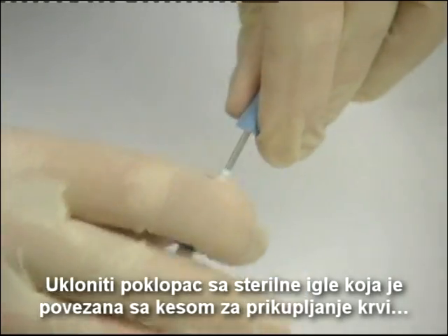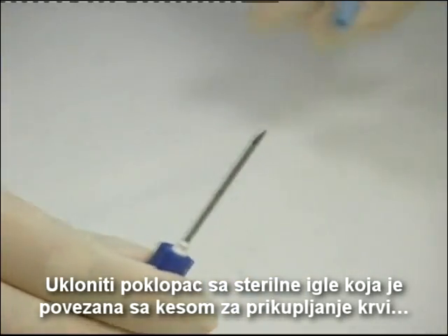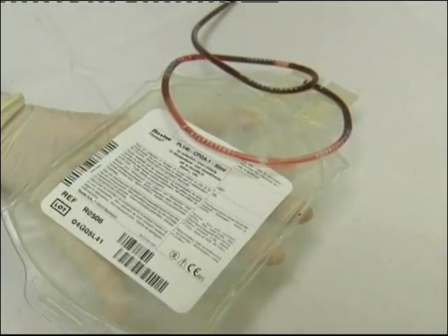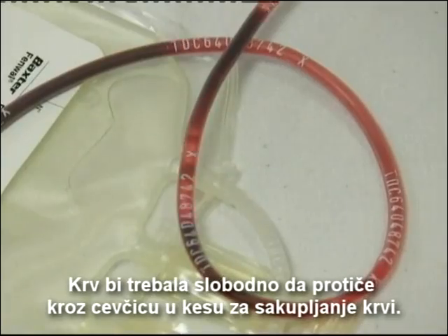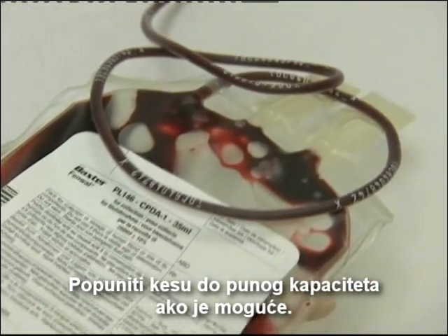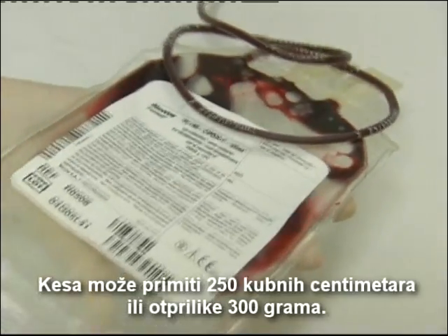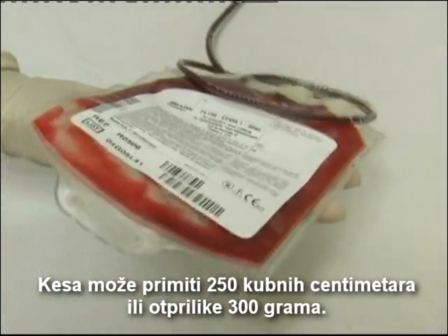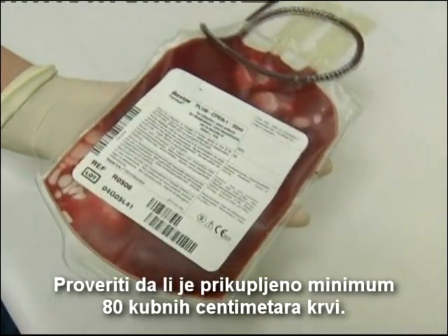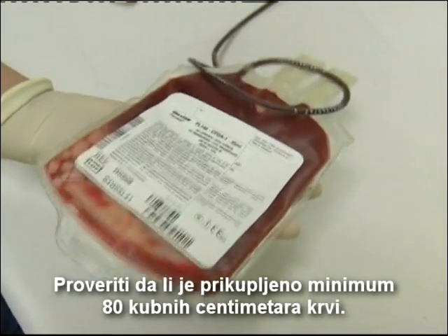Remove the cap from the sterile needle connected to the blood collection bag, and insert the needle in the disinfected area. The blood should flow freely through the tube into the blood bag. If possible, fill the bag to its full capacity. The bag can contain 250 cc's or approximately 300 grams. Please ensure that a minimum of 80 cc's of blood is collected.